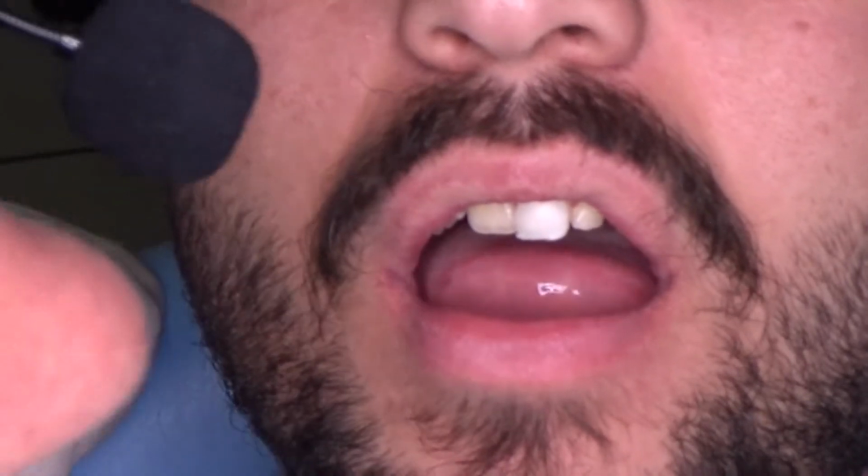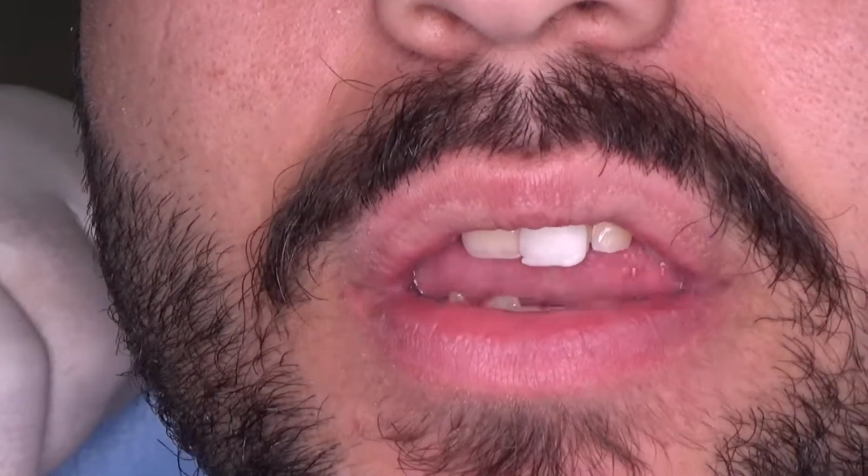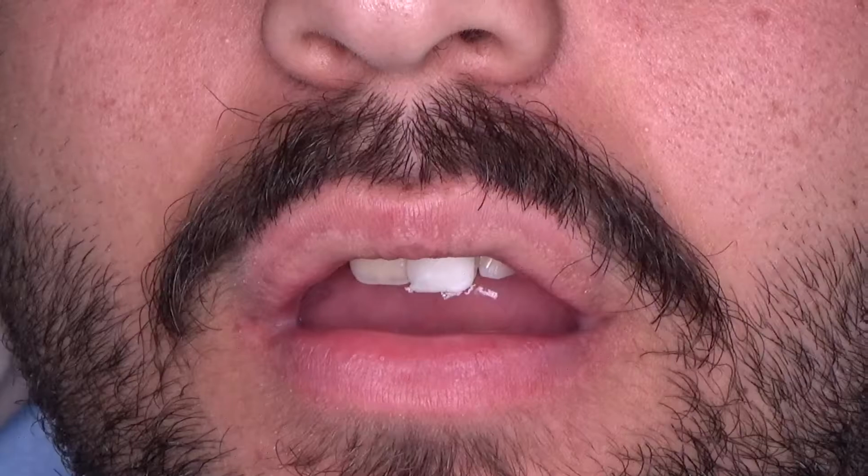Okay. So we define the new position of the tooth, and we are ready to scan the jaw to make an STL file. This is the first option. The second option, if we don't have an intraoral scanner, we can take an impression of the mouth with the mock-up on the central incisor, send it to our lab along with the link that I showed you before, and they will upload the STL for us.